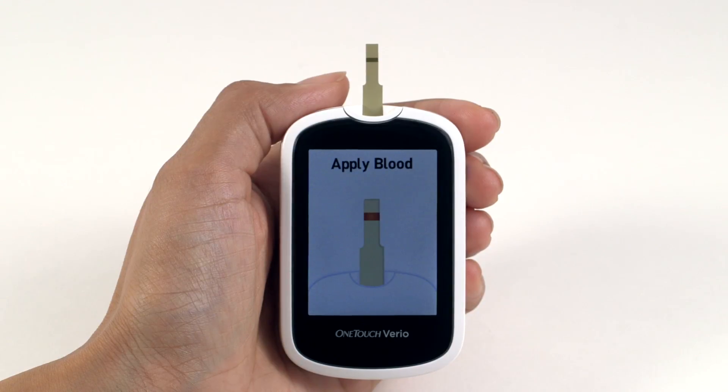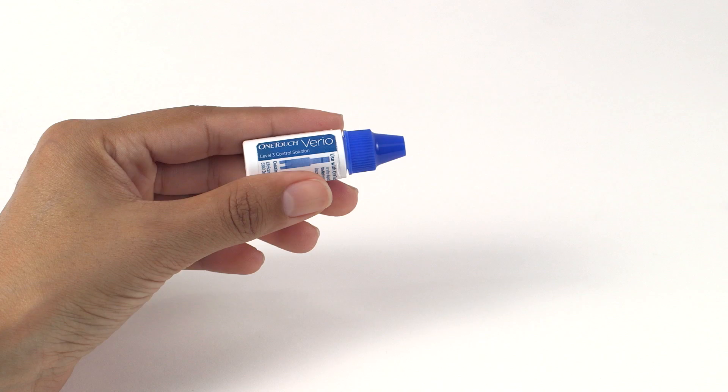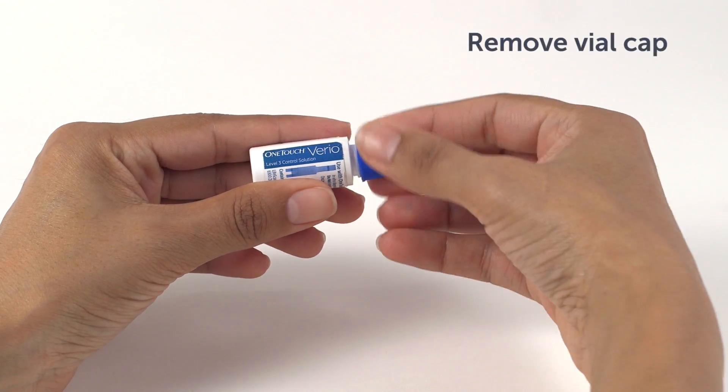Let's put it to one side while we prepare the Control Solution. OneTouch Vario Control Solution and test strips are available separately. For availability, contact customer service or ask your pharmacist or healthcare professional. There are two Control Solution options available: OneTouch Vario Level 3 Control Solution and OneTouch Vario Level 4 Control Solution. When a new vial of Control Solution is opened, record the discard date on the vial label — this is the date opened plus six months. Do not use after the expiry or discard date, whichever comes first.